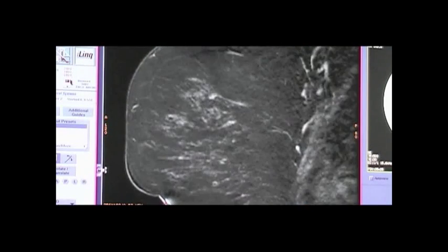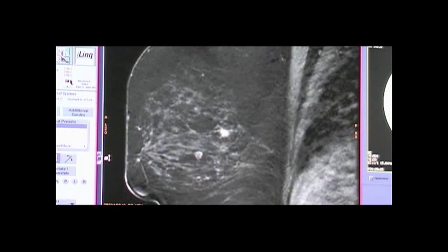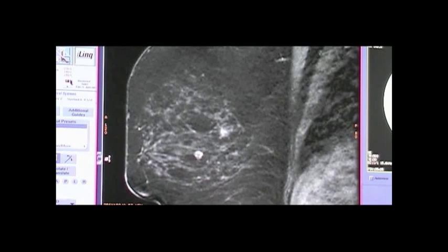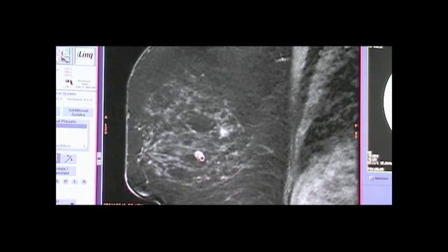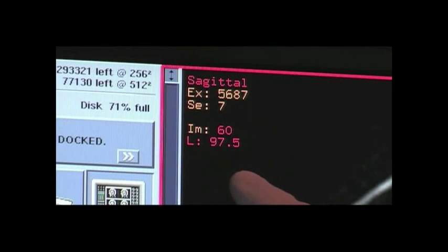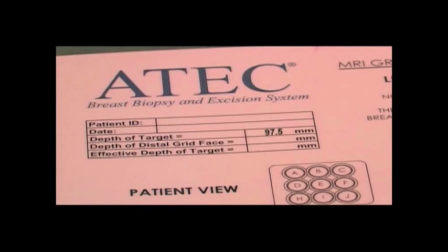Administer the contrast agent and begin the scanning sequence. The manual targeting method requires a sagittal sequence. Review the images and scroll to the image containing the visible lesion. Place a marking cursor over the lesion on the monitor. Record the image left or right value from the center of the magnet on the grid worksheet in the space marked depth of target.